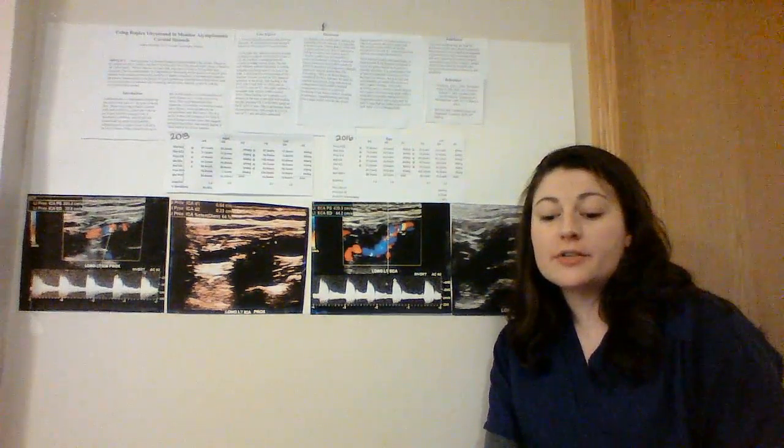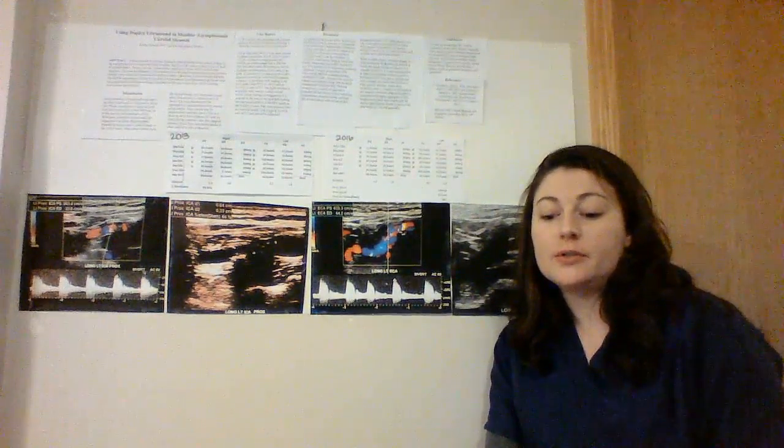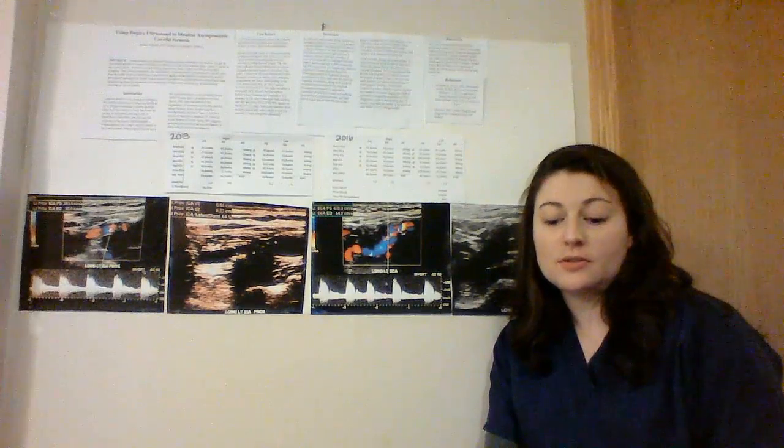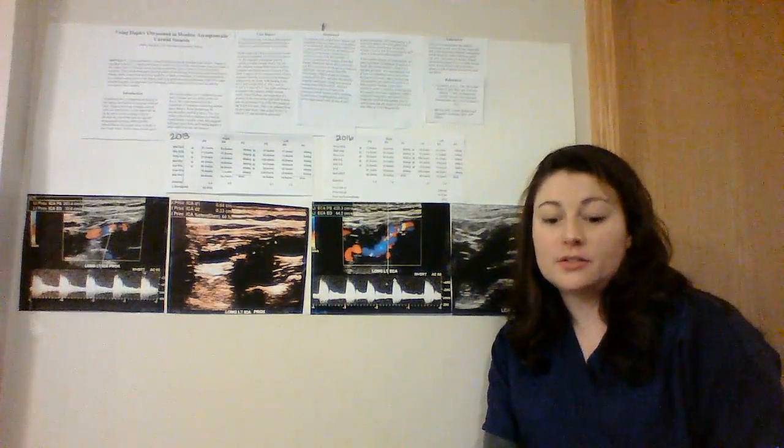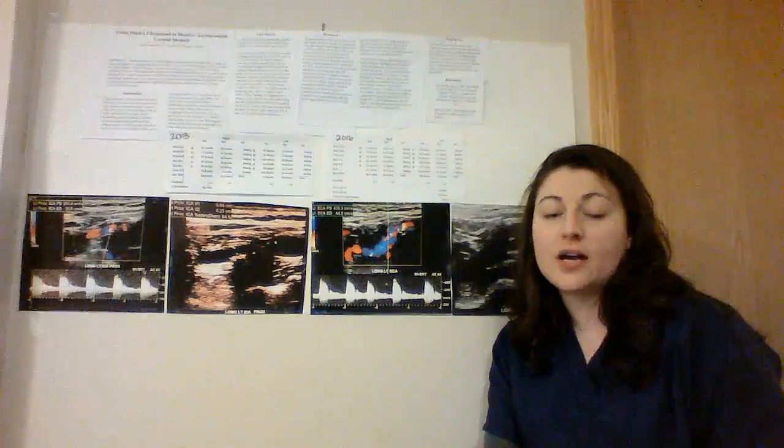For patients with carotid artery disease, and especially with a known stenosis, it is important to monitor, and duplex ultrasound is often used due to its lack of radiation and the lack of contrast dye used to visualize the vessels. A review of non-invasive imaging found that duplex ultrasound has an 86% sensitivity and an 87% specificity for diagnosing a significant stenosis greater than 70%. Mild to moderate disease is considered 30 to 50% stenosis, and that indicates the need for ongoing surveillance, as well as medical management.